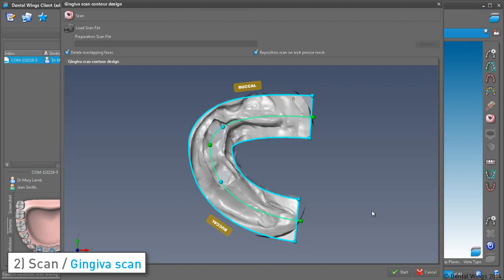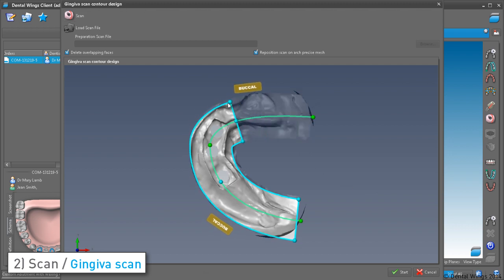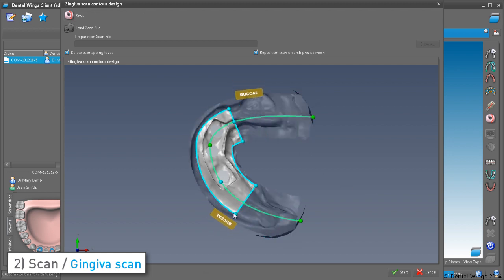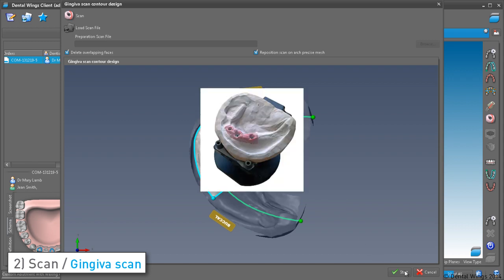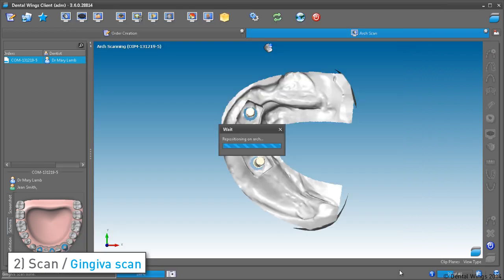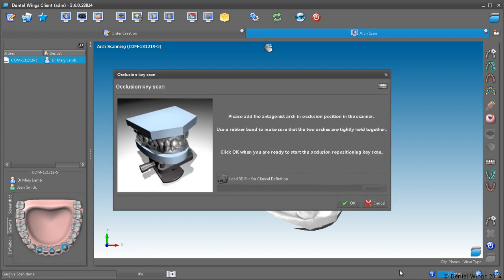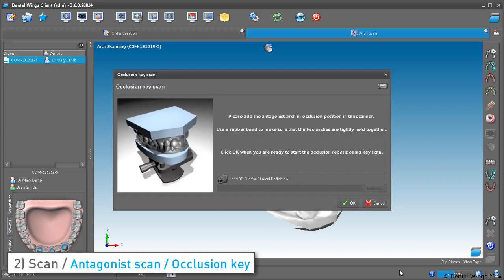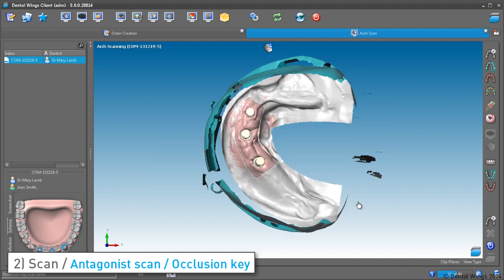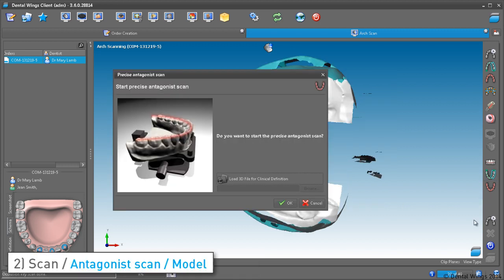The gingiva scan dialog pops up, where you define the gingiva scan area. When it's done, the antagonist scan procedure is initiated. In our case, we have requested a positive model scan, so we're prompted with the occlusion key scan.